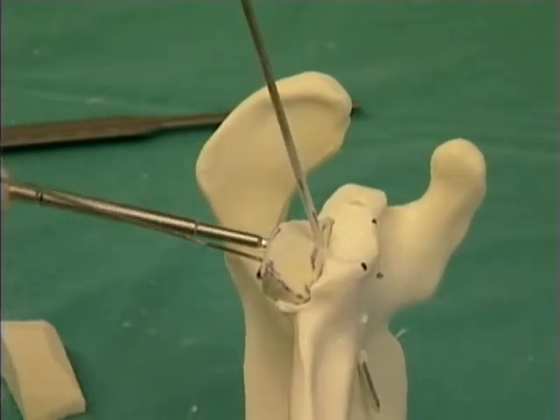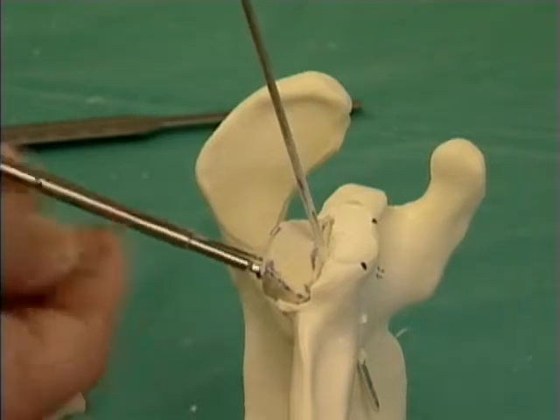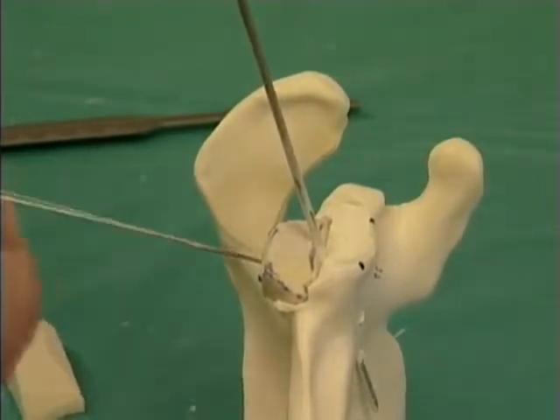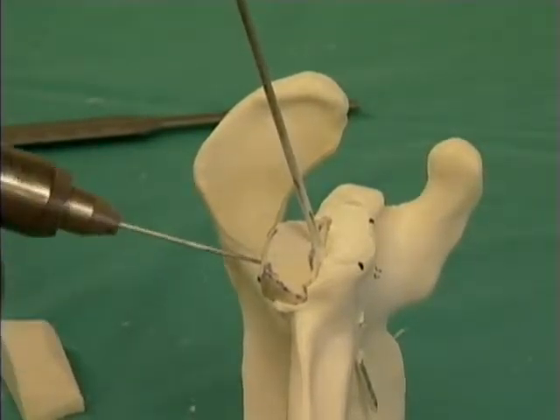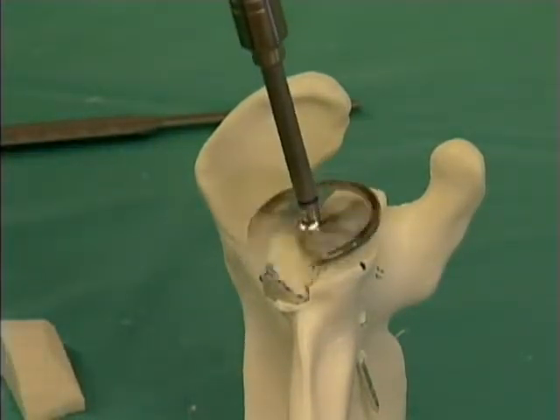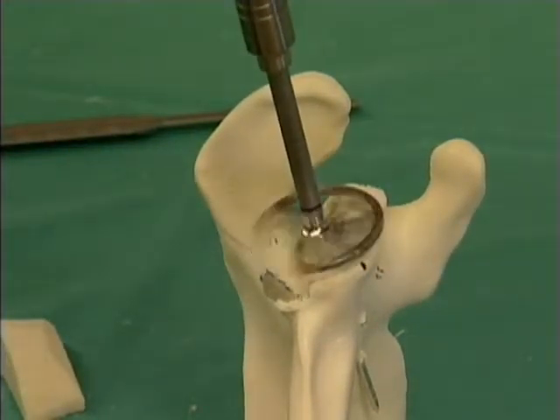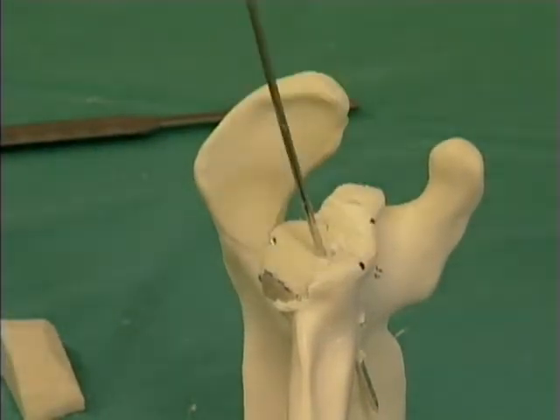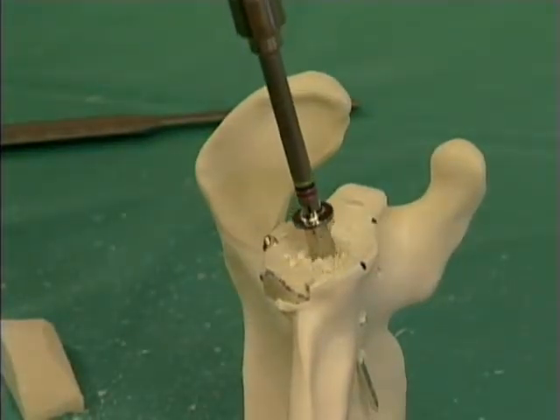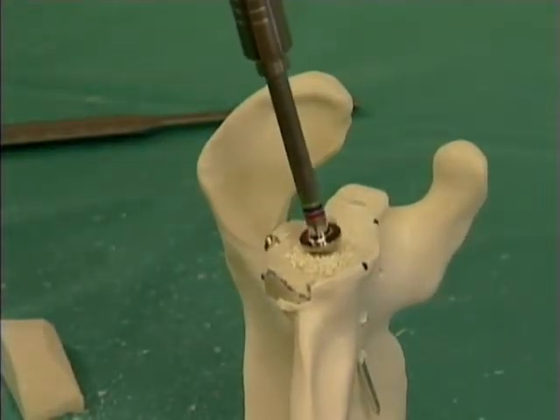After placement of the screws the center guide pin is removed. You can see in this demonstration excellent compression of the graft into the defect. The reamer is then used to create an even surface from anterior to posterior and the center drill hole is made for the center peg of the implant.